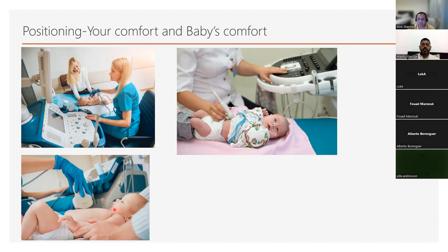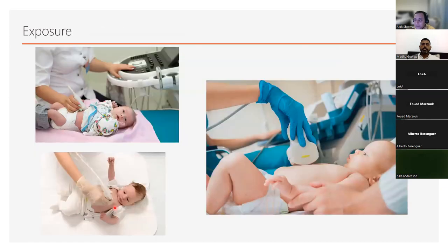So again, exposure is not just about having the baby exposed, but really, is the baby in a cot? Have you thought about how you're going to do this? What about moving a baby who has an evolving pneumothorax? These are all significant challenges. They create problems with how you scan. And we'll talk about how you can make this better.